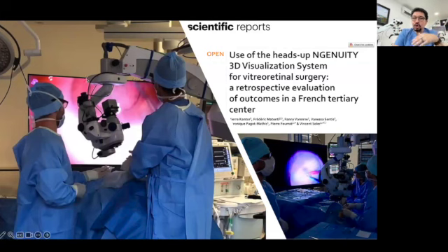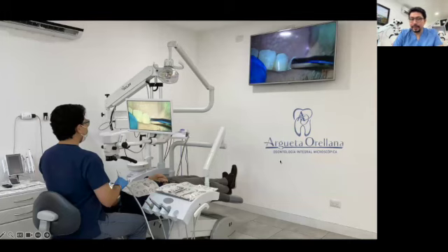So it's not a new technology. What is new is that Seiler managed to bring this technology into dentistry, which is a big accomplishment. So let's analyze the distances. This is how we work here in the office. You see that the screen is just in front of me.